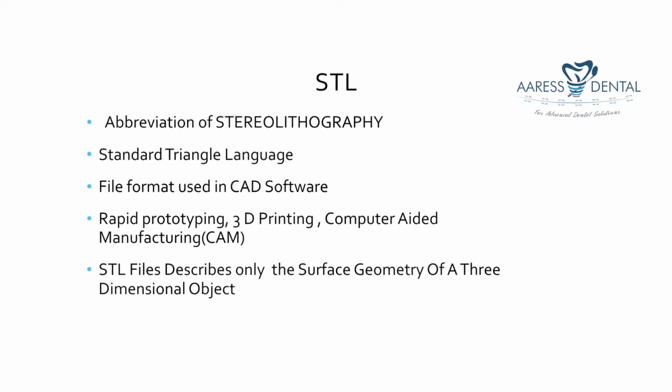STL is another important term that will be mostly used in digital dentistry. It stands for stereolithography. It is a file format that is used in the CAD software. We design the processes and the file we get from the process is the STL file. It is also useful in rapid prototyping, 3D printing, computer manufacturing, everything. STL files also describe the geometry of a three-dimensional object.